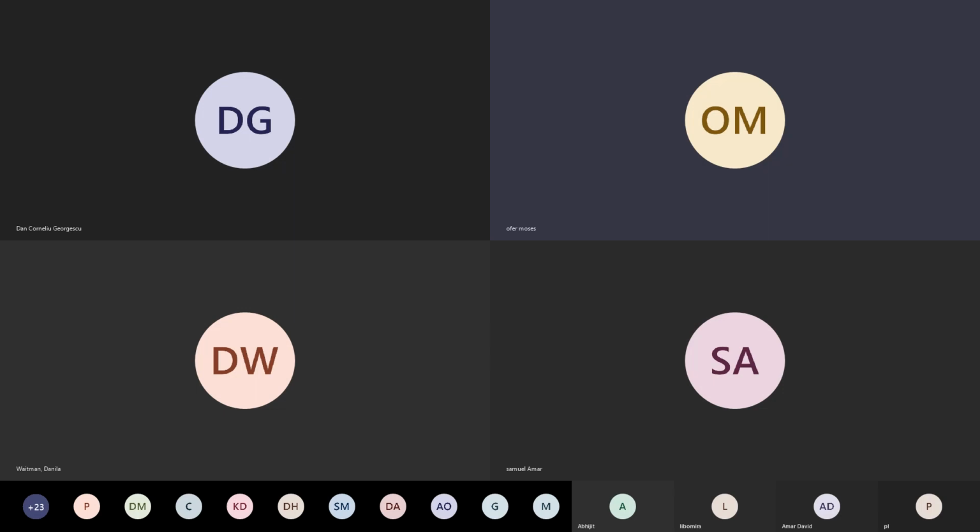Magnetic mallet works in another way, but actually the principle is that it goes into the bone and you don't lose bone. In the piezo, in order to cut, you lose a little bit of bone. That's why you need to have 3 millimeters. If you're using a magnetic mallet, you can look for it on YouTube. There are some good videos. Then you can do a split in 2 millimeter width. But with the piezo, it's at least 3.